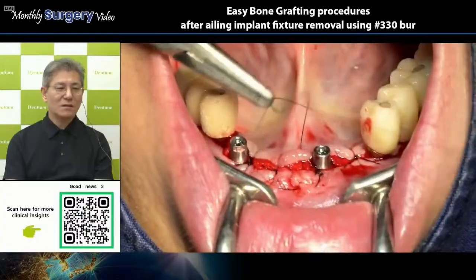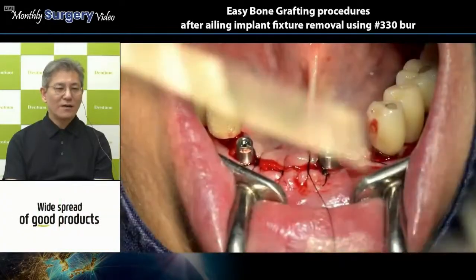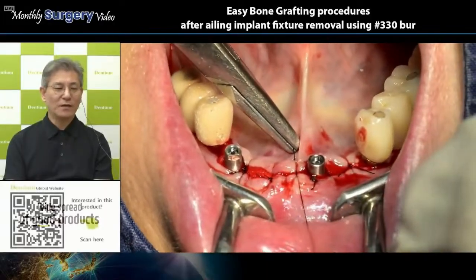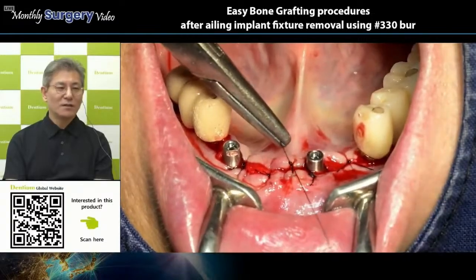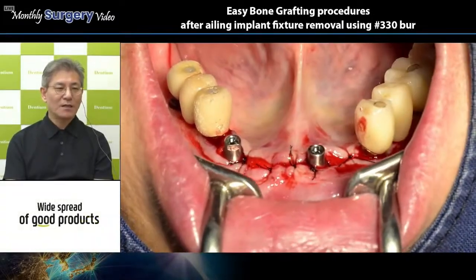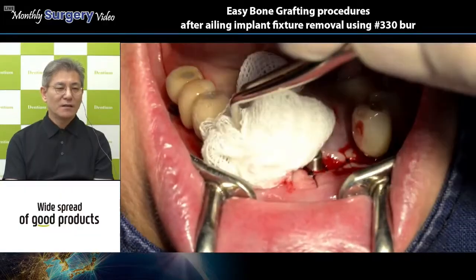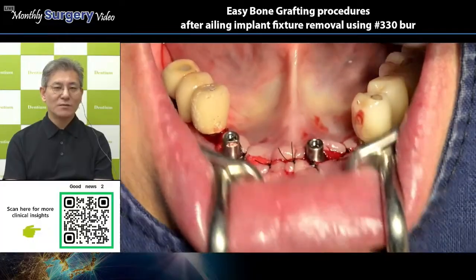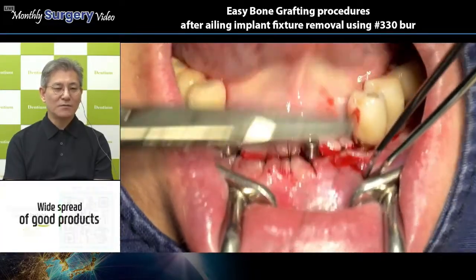So Dr. Zhang is going to scan this patient after 2 weeks at the time point of stitch out, make a scanning and take a file, and then make a temporization, the temporary prosthetic procedures. The prosthesis will be applied for this patient.